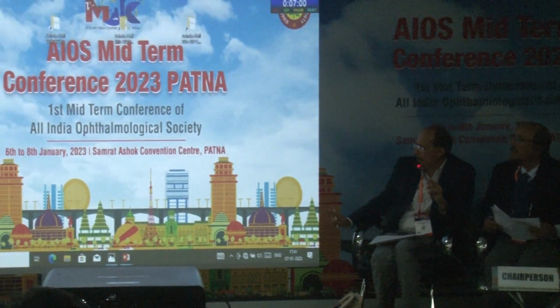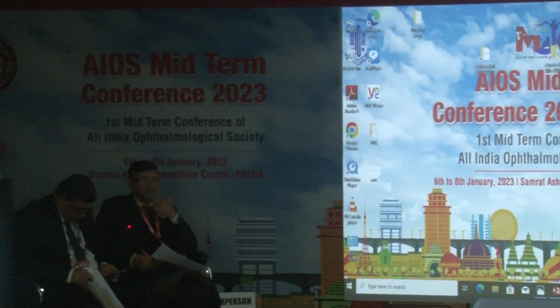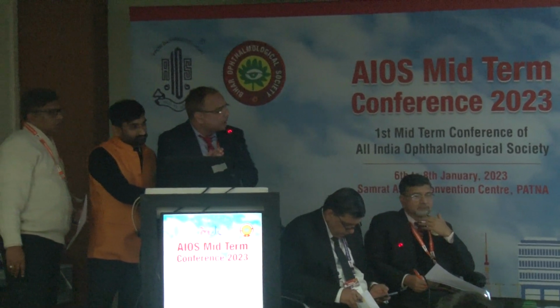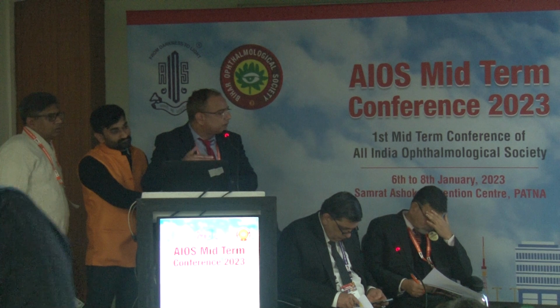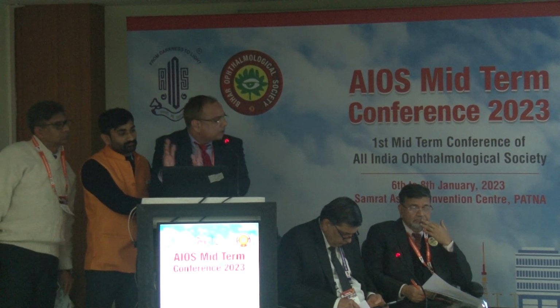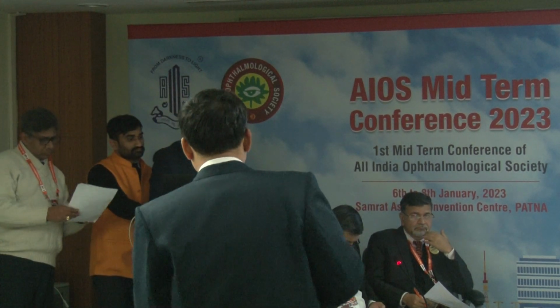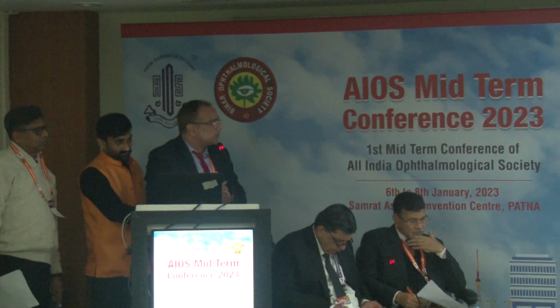It was a website, right? And it is smartphone based. So the images were sent to the retinal specialist and they graded those images. On the basis of that validation, an AI algorithm was formed that can finally diagnose, and it was the referral sort of thing, meaning that for this image the patient needs to go to a higher center. This image is normal, so the patient just needs regular follow up, fundus examination is needed. The referral to the tertiary center is not required. So it's a referable sort of system.